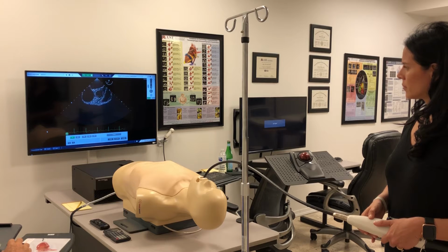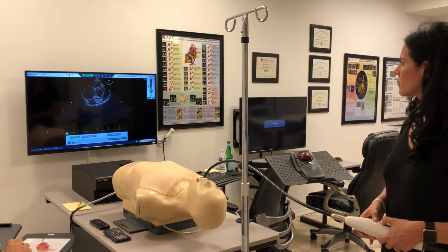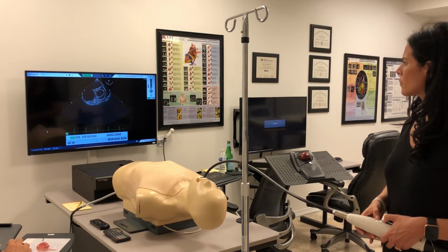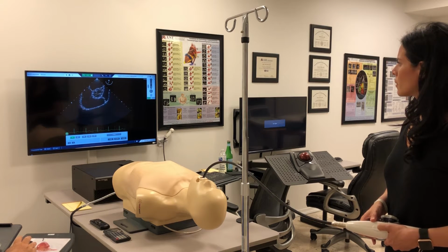The next view is just this view, but with 20 more degrees. We're going to develop the mid-esophageal RV inflow-outflow view. So let's go to 60 degrees. And we're looking for a nice symmetric pulmonic valve and an opening tricuspid valve.